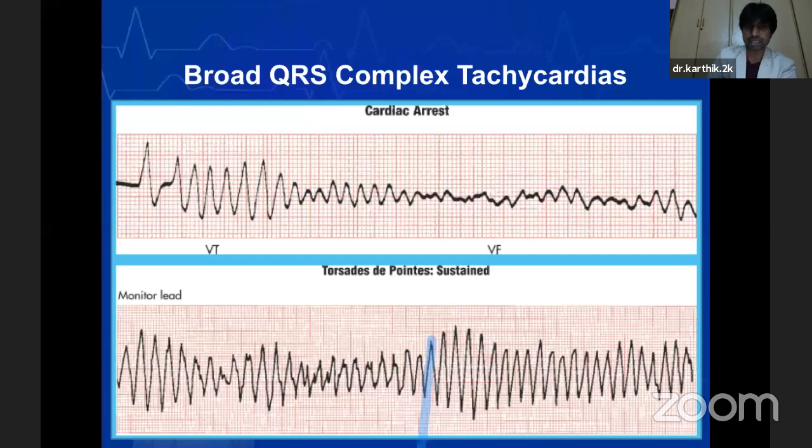Now, in the first strip here, you can see the cardiac arrest, a patient who is almost arresting. There is ventricular fibrillation. You don't see a definite pattern of a QRS complex. It is just like a sine wave, like some electricity recording, so this is almost a failing heart. When you see this on a monitor or an ECG strip, you should immediately jump up and start cardiopulmonary resuscitation, because if you don't do CPR for these patients, they will definitely not make it out. And in the bottom illustration, you can see another example of a wide QRS complex tachycardia.